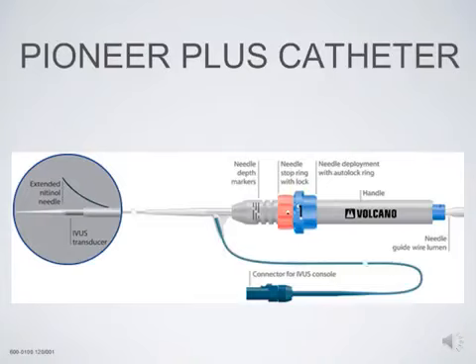You have the needle on the left, as you can see, that comes out in a curved fashion, and as I said, the wire that comes out from the needle will go from the distal needle guide wire lumen, and the IVUS transducer is just ahead of this, the needle where it comes out. As you can see, the needle should be puncturing right about the site of the IVUS transducer. And then at the bottom you see the connector to the IVUS console.